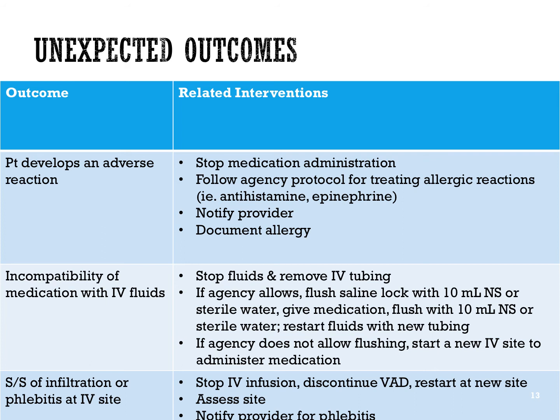So what you will see is complaints of discomfort or pain, swelling around the site. It will feel cool. Sometimes the skin looks really tight. If there's a lot of fluid in the tissues, there could be blanching or redness. And usually what we do in this case is elevate the site. You don't necessarily have to notify the provider for an infiltration unless it's huge.